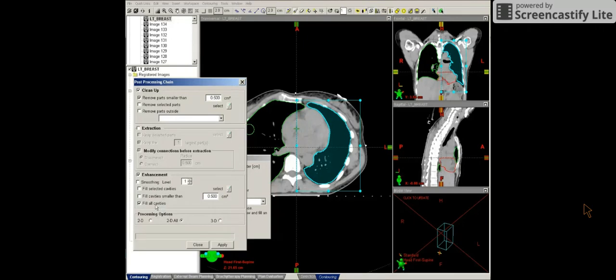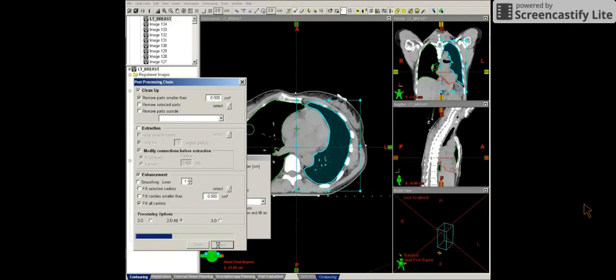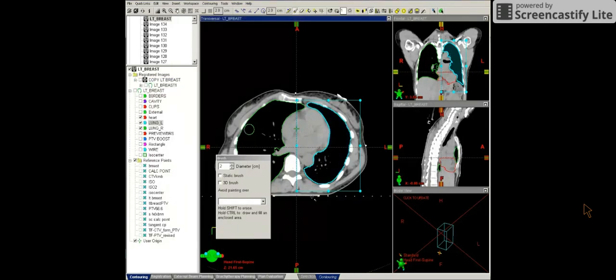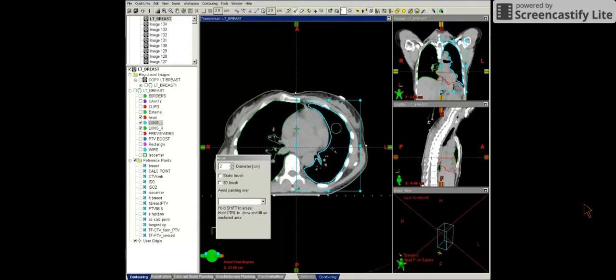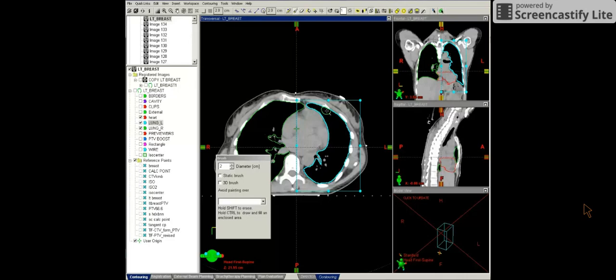Now I'm going to go to post-processing and this will help clean up the structure. So I want to make sure I select fill all cavities and remove parts smaller than 0.5 cm squared. So this helps clean up the contour and reduces the amount of hand editing that I have to do.